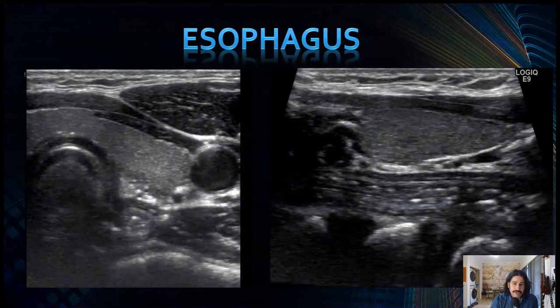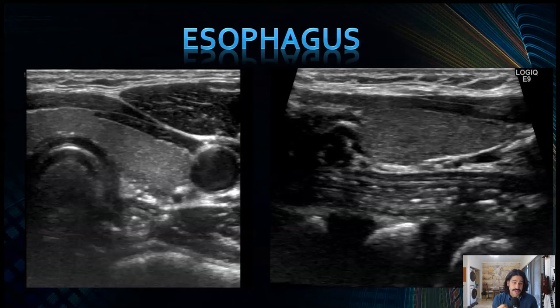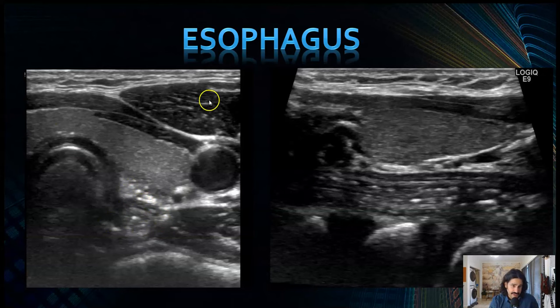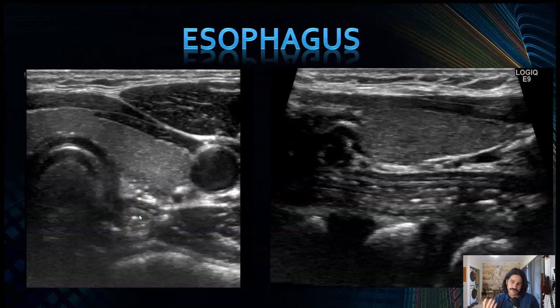The gastrointestinal system begins in the mouth — the tongue, the salivary glands create saliva which begins the digestion process, and the teeth chew the food. Then it goes down the esophagus into the stomach and so forth. In a transverse view at the level of the thyroid, you can usually see the esophagus posterior to the left lobe of the thyroid. So here's your carotid, isthmus of the thyroid, left lobe, esophagus, sternocleidomastoid, and trachea. It'll be posterior to the left lobe and lateral to the trachea, especially visible in skinnier or younger patients.